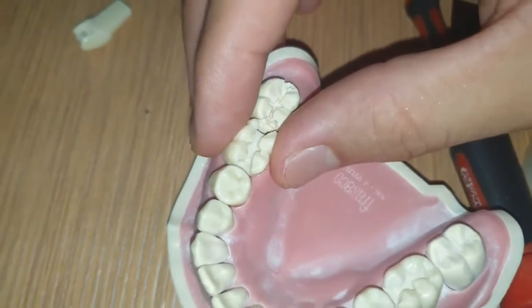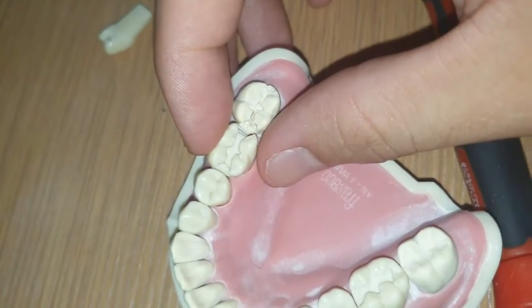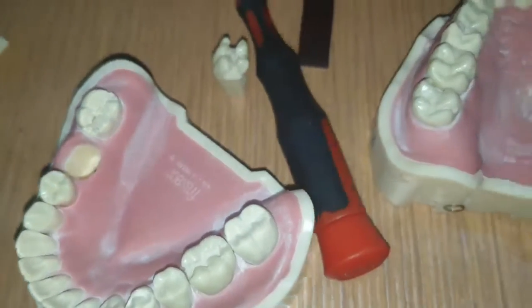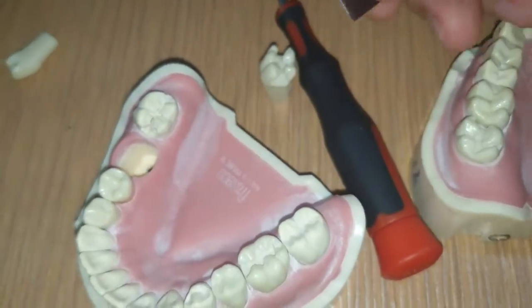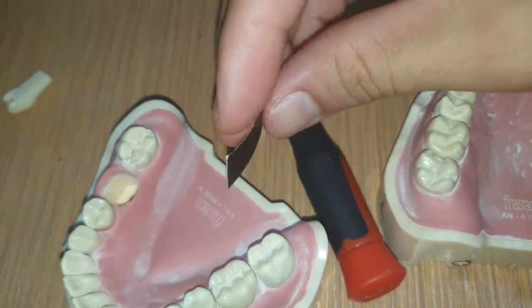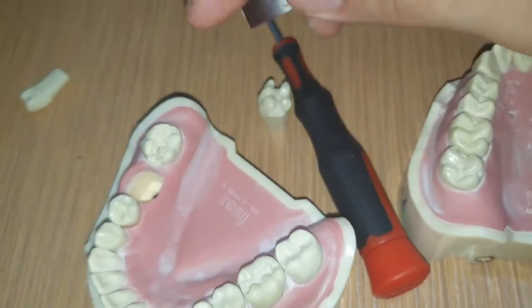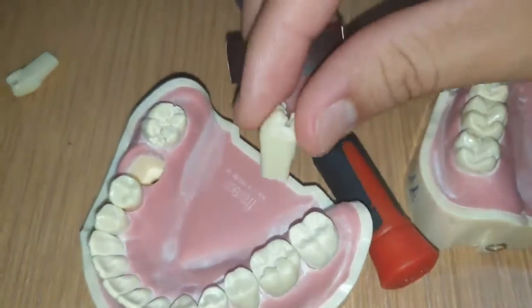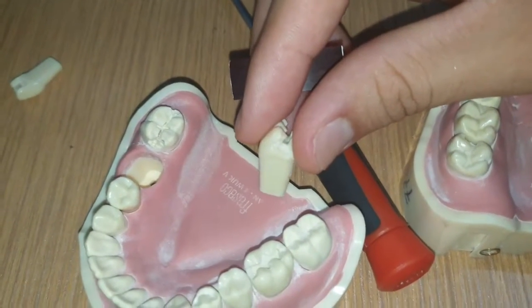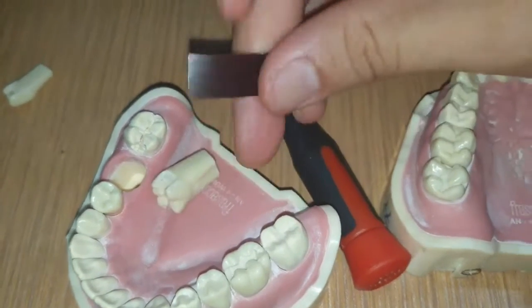So what can I do? I need to check whether I am damaging the adjacent tooth as I make the proximal box. So here, I have brought a strip of sticker, and I'll cut it and paste it on the proximal surface. This empty void space — I'm going to fill it up with this sticker.